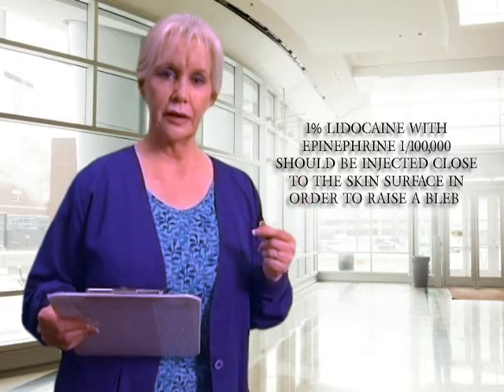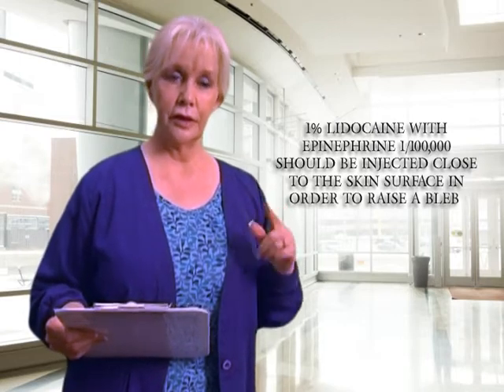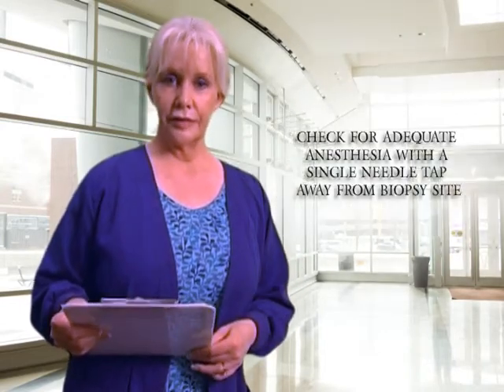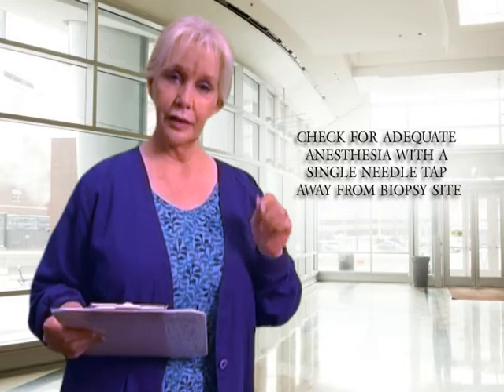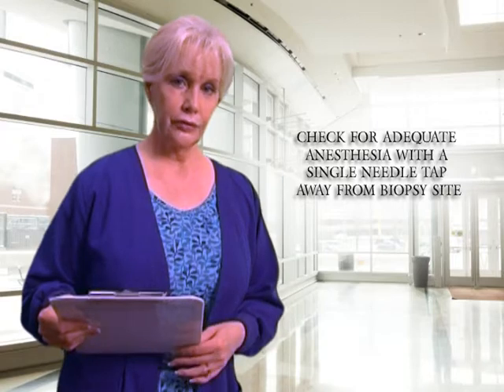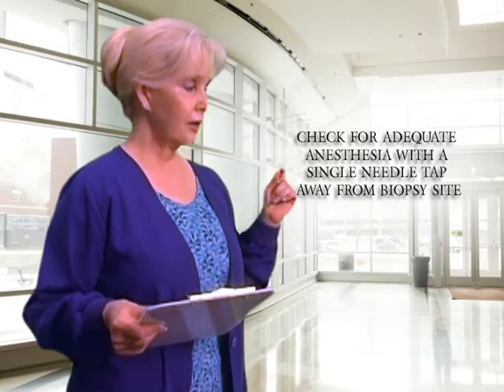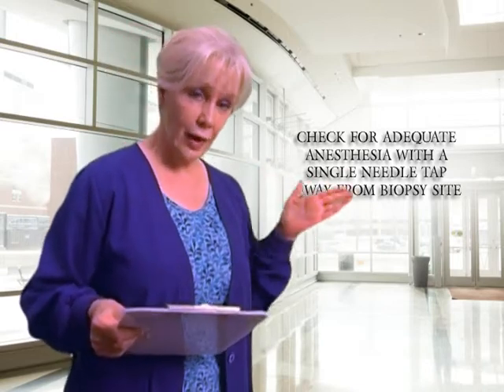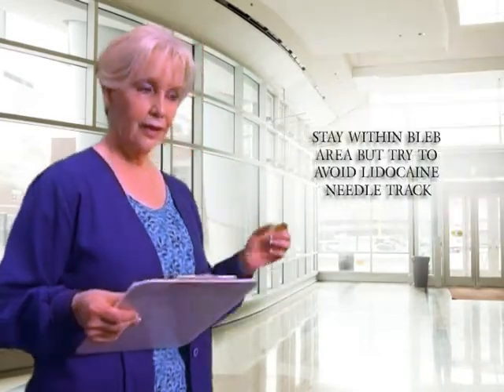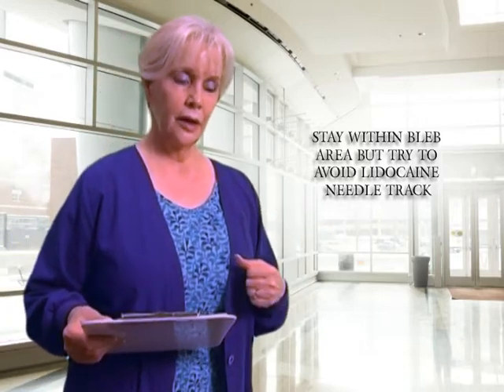When using the lidocaine, be very careful to inject just directly under the skin. If you go too deep, the patient is going to feel it. It's the superficial part of the epidermis that needs to be numb. I like to check by tapping a time or two with the lidocaine needle and they'll let you know if they feel it. Stay within that bleb area when you go to do your biopsy.